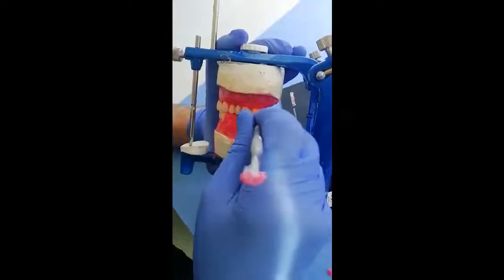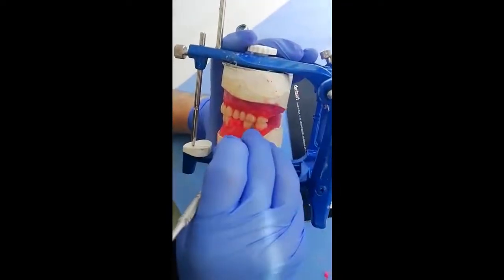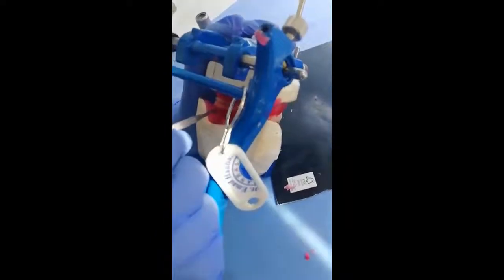Now, as long as the wax is still soft and warm, we can do minor adjustments, and you have to observe the occlusion from the lingual side.